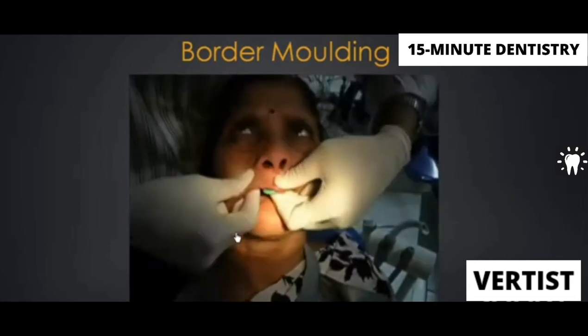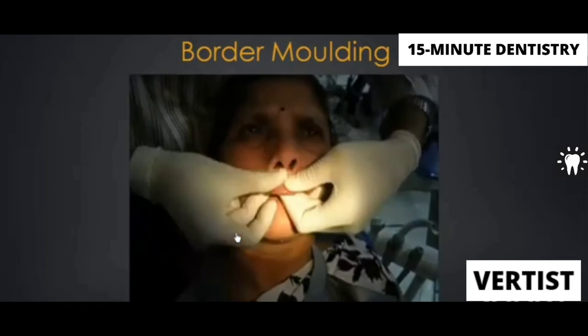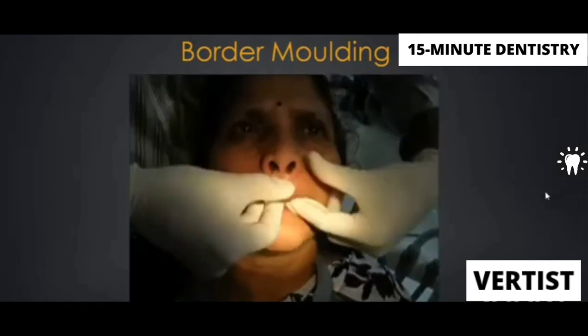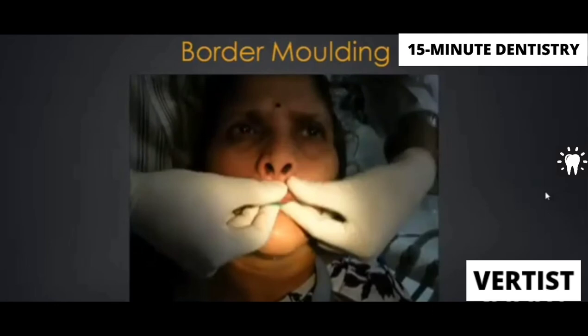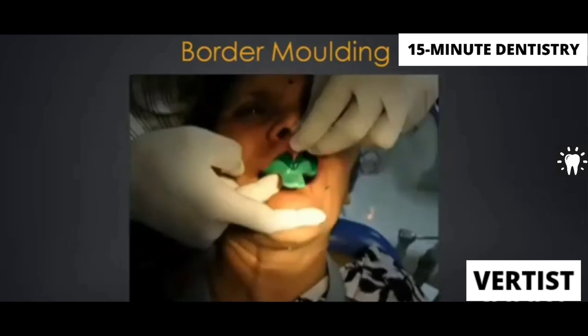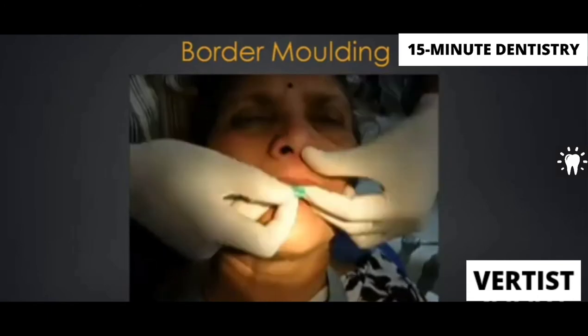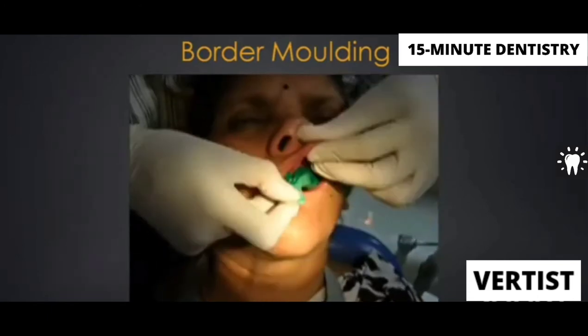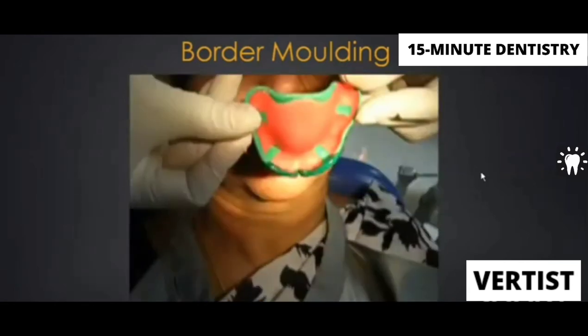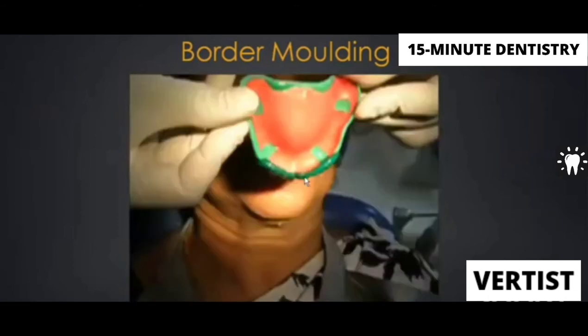Okay, then we take some material, add on the buccal. For the buccal frenum, we just take the cheek up, out, down, and then we do a little anterior and posterior movement. That anterior and posterior movement is done because there are muscle attachments in the buccal frenum. Right, you can see this anterior part being molded nicely.